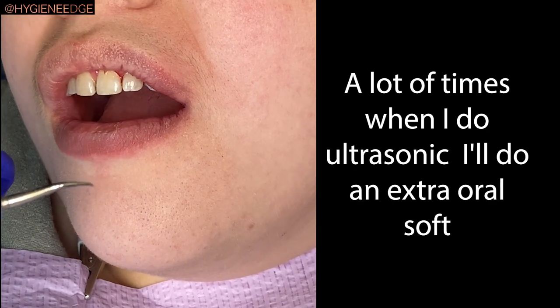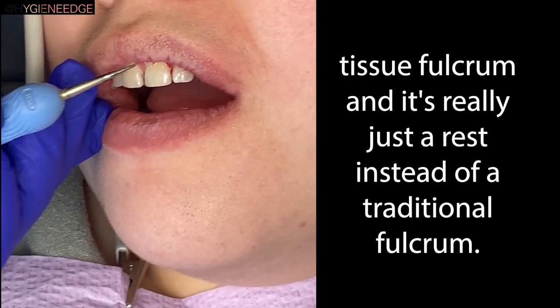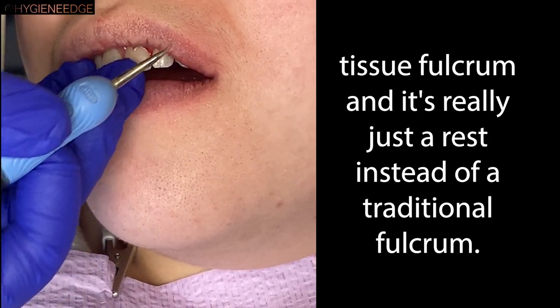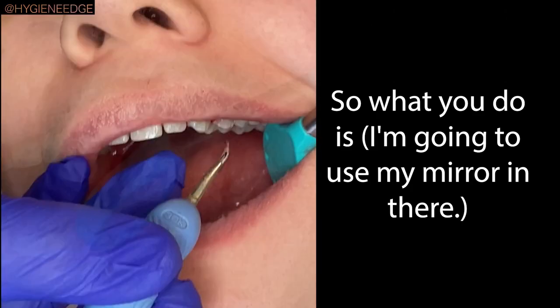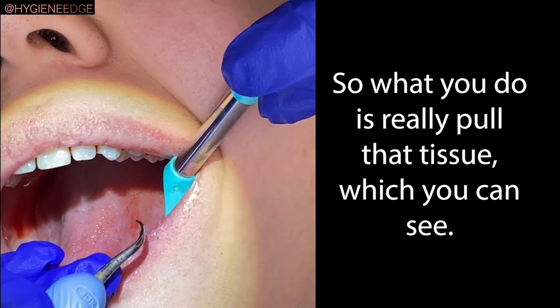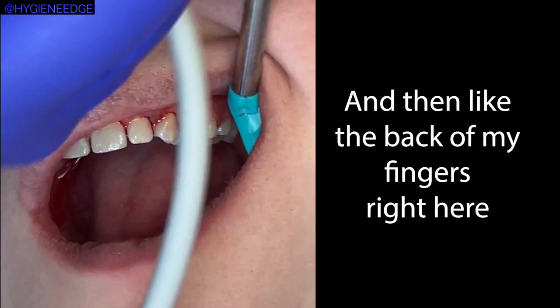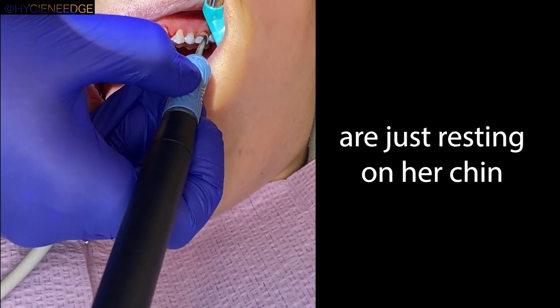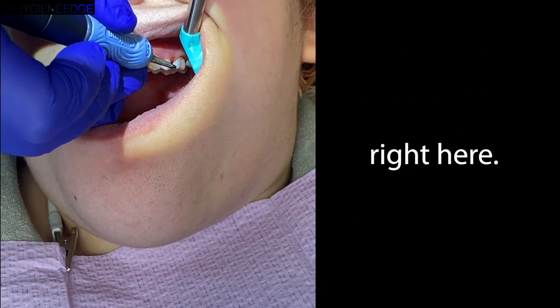A lot of times when I do ultrasonicing, I'll do an extra-oral soft tissue fulcrum, and it's really just a rest instead of a traditional fulcrum. So what you do is, I'm going to use my mirror in there — really pull the tissue away so you can see — and then the back of my fingers right here are just resting on her chin, and I'm going to instrument that way.